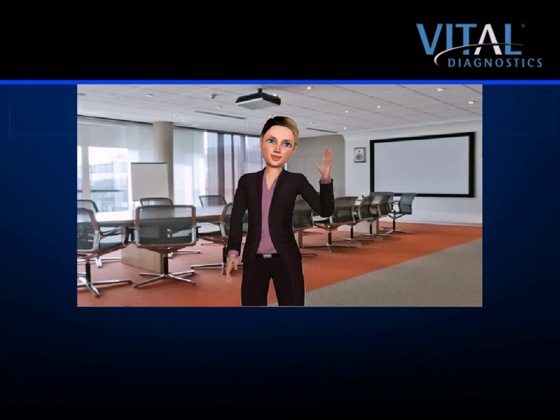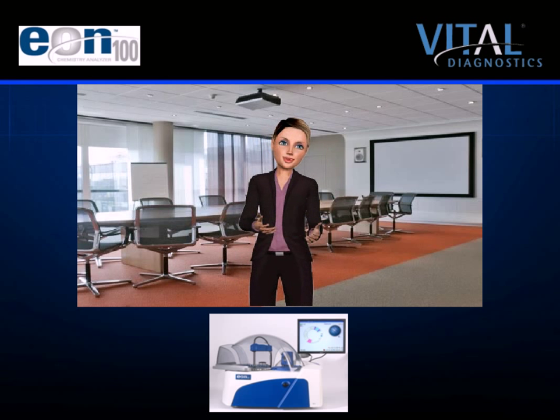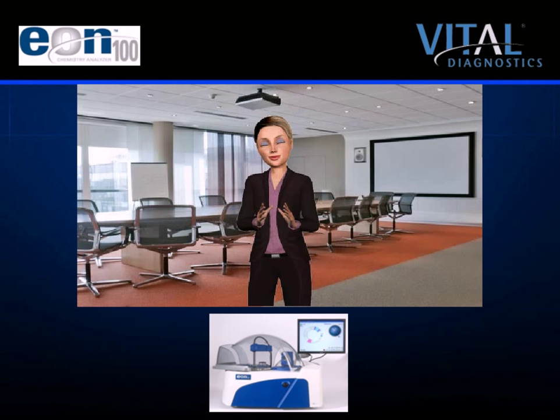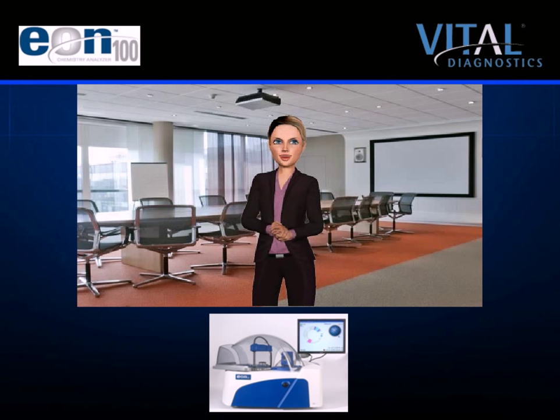Hello, and thank you for taking the time to learn more about the EON100 Chemistry System. My name is Kate, and I am the Senior Marketing Avatar for Vital Diagnostics. It is my pleasure to be your host today. I am joining you by video conference from our virtual boardroom. For your convenience, you can view this presentation at your pace by use of the toolbar at the bottom of the screen. You may pause the video at any time, or use an embedded hyperlink for easy return. Sit back and enjoy the demonstration on the wonderful EON100 Chemistry System.